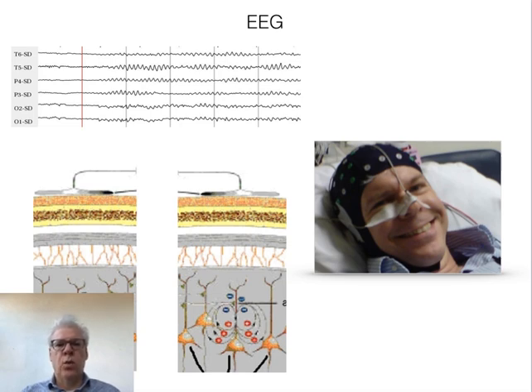We will not go into detail why this is the case, which is neither trivial, but the observation is that apparently the pyramidal cells tend to oscillate, creating rhythms that we can record with the EEG. And it's mainly the currents resulting from the synaptic input that are responsible for the EEG. It's not the action potentials, it's the synaptic input, excitatory and inhibitory postsynaptic inputs to all the pyramidal cells in the cortex that are in part synchronized, resulting in these brain rhythms.